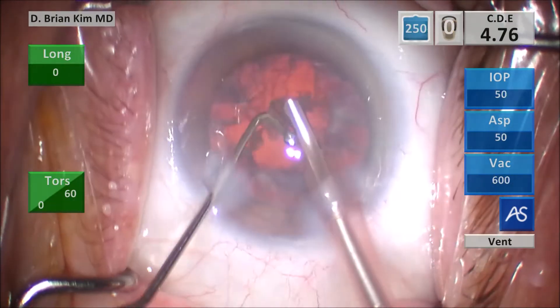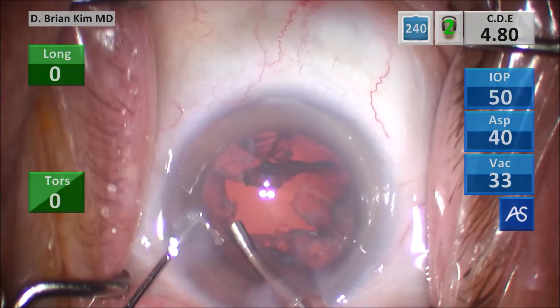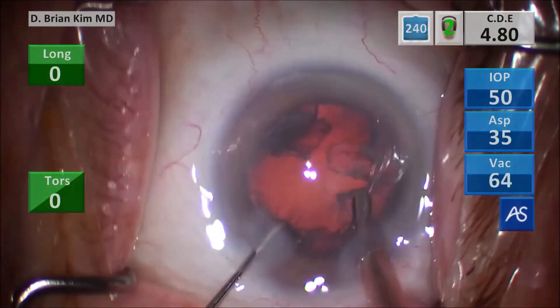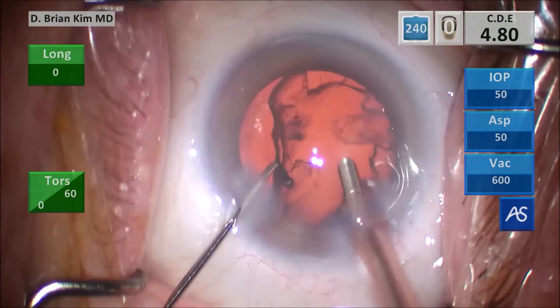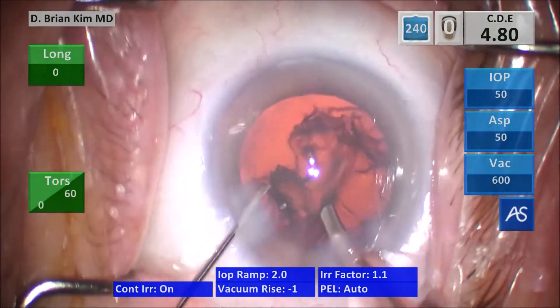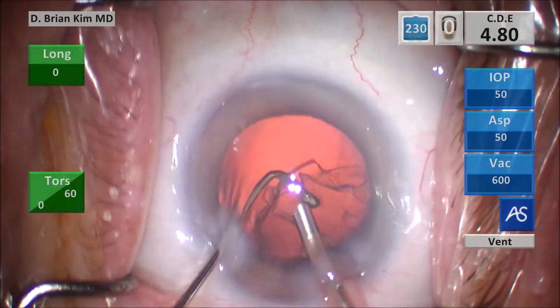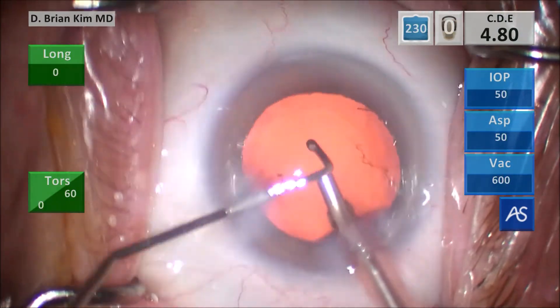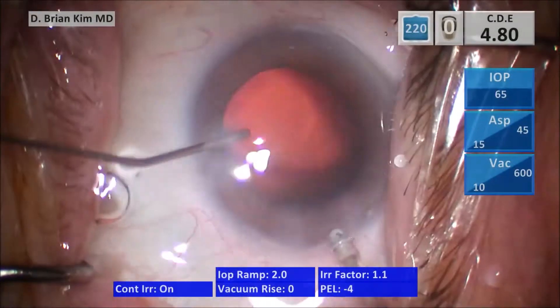Now I just have epinucleus left. It's a little bit stubborn. You want to be a little bit careful in this situation — you don't want to be grabbing the lens material and then grabbing the bag. But I obviously have confidence here, and it's hard to tell in the video, but three-dimensionally, I must feel confident that the posterior capsule is back. So I take the chopper out, push BSS in, take the phaco tip out, and I go in with the I/A handpiece.